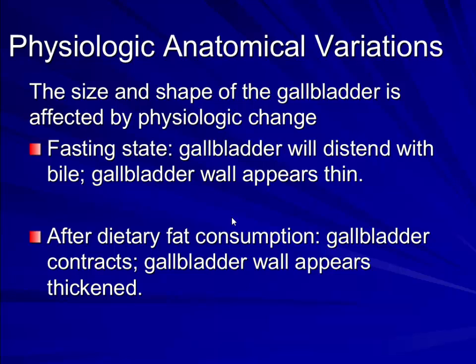However, the appearance of the gallbladder varies with physiologic changes, depending on whether or not you have eaten. During fasting, the gallbladder distends with bile, and the gallbladder wall appears thin. But after taking a fatty food, the gallbladder contracts, and the gallbladder wall appears thickened.